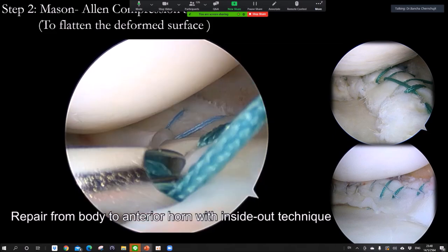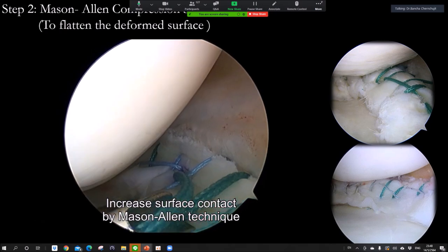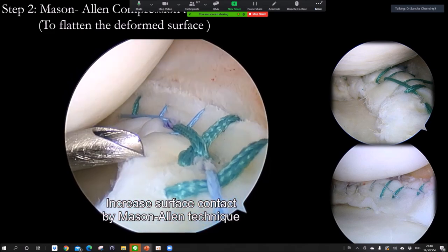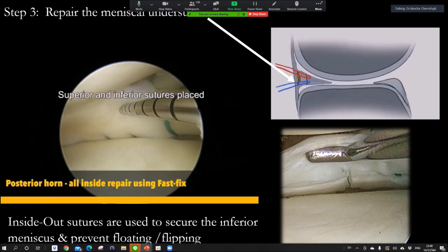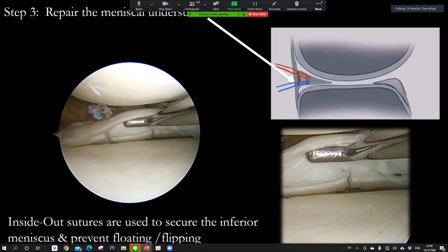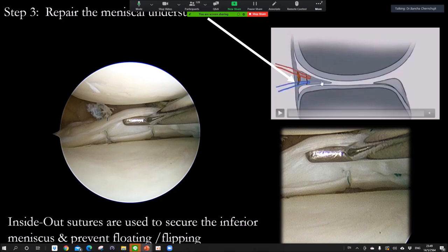For chronic meniscus cases, the meniscus may become deformed. I use the Mason-Allen stitch to flatten the deformed meniscus and also improve the contact area. This works very well for the chronic deformed meniscus, and I published this technique in Arthroscopic Techniques. Don't forget to repair the undersurface — if you only repair the upper surface, the undersurface will remain open and it won't heal. Always repair both upper and undersurface of the meniscus.